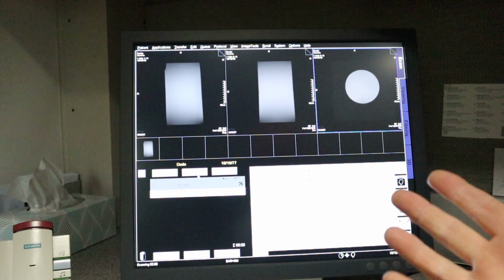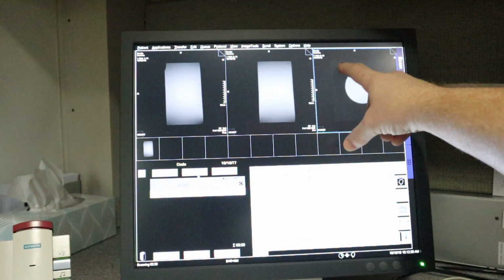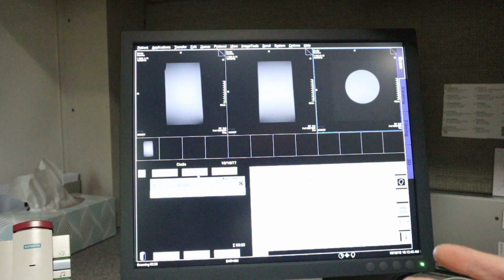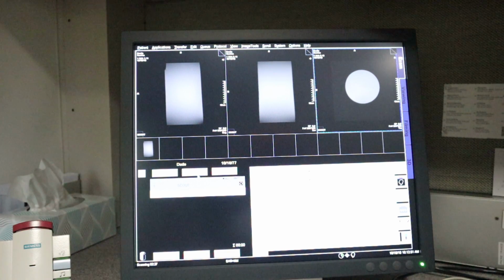And so it's going to scan, and that's one tip and trick that you can do if you're having a fat sat issue or a muted image issue, or if one side is sharp and one side is not. You can adjust the volume over the image that you're scanning. One thing to keep in mind is that if the yellow box doesn't fully turn green and you get a green box over the yellow box, just make sure that you adjust the green box to be bigger than your field of view for the yellow box.